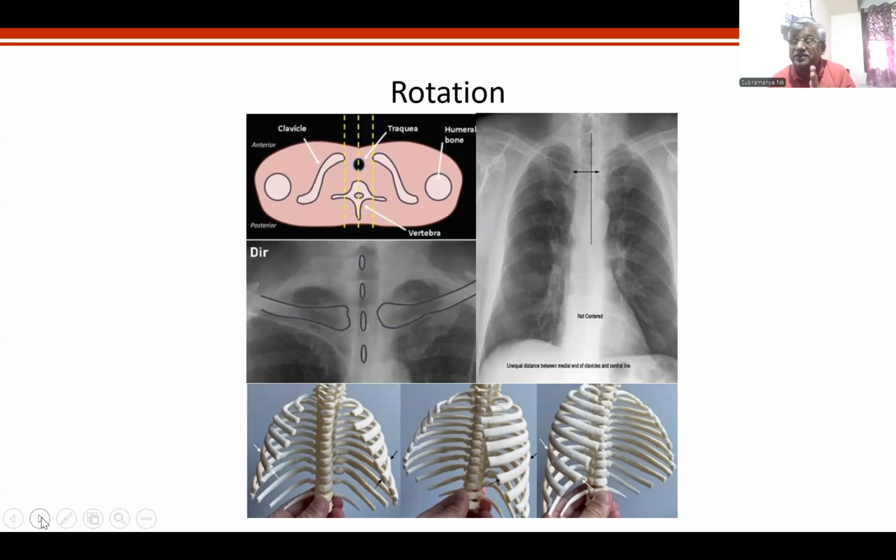We are not specialists in interpreting oblique X-rays, and for that you should know oblique X-ray anatomy. You understand? You cannot know the anatomy of an anteroposterior film and interpret an oblique by extrapolating. It's just impossible. If you want, nobody prevents you from reading oblique anatomy. You read oblique anatomy, become the master of it, and start interpreting oblique X-rays. I have no problem, but till that point of time, you should not.